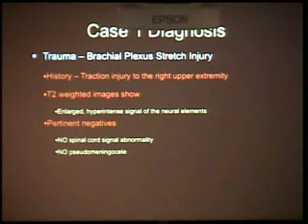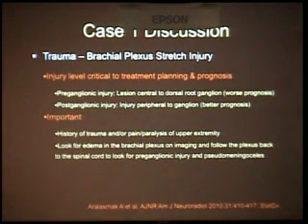The nerves on that side were just barely enlarged and hyperintense. Luckily, again, no pseudomeningocele or cord injury. So again, preganglionic injury would have been worse. Typically, those patients just go to physical therapy. They don't have a great chance of recovering.